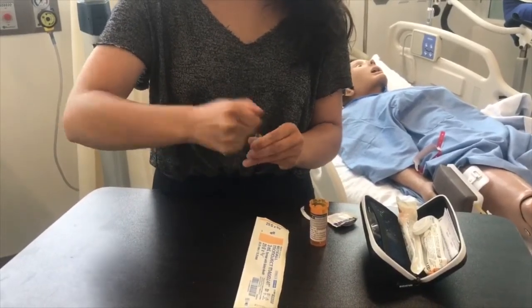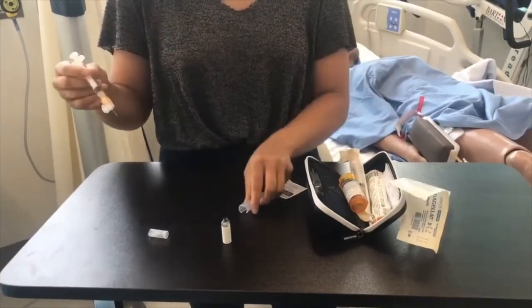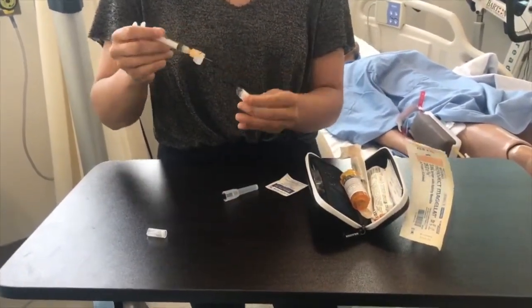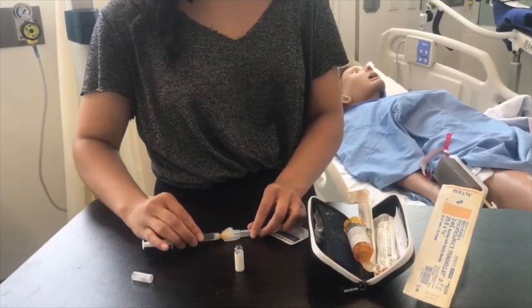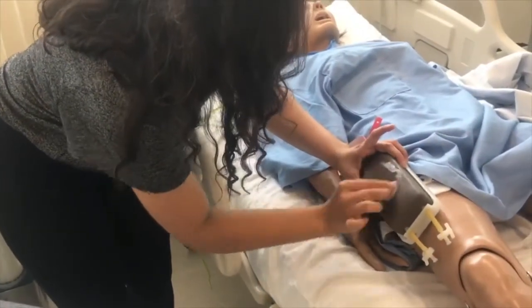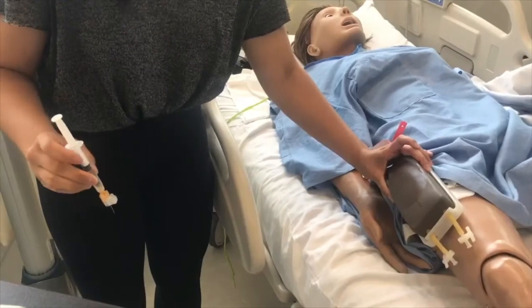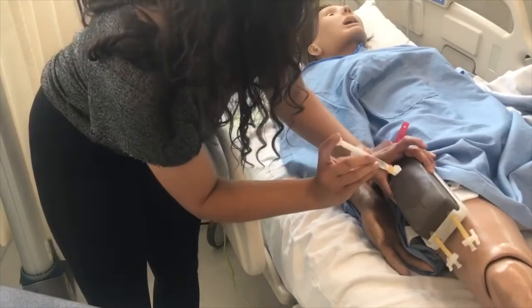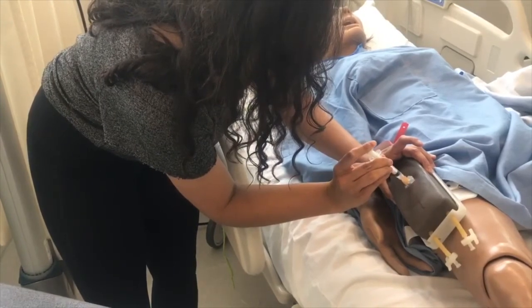Open the naloxone ampule. Draw up the medication. Give the medication into the vastus lateralis. This is the preferred site. The injection should be given through the patient's clothing.